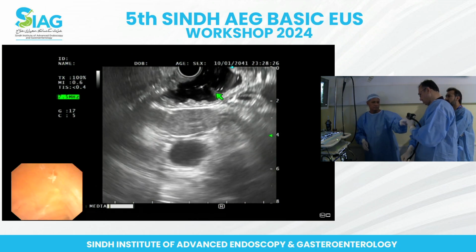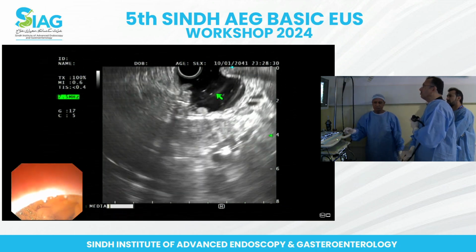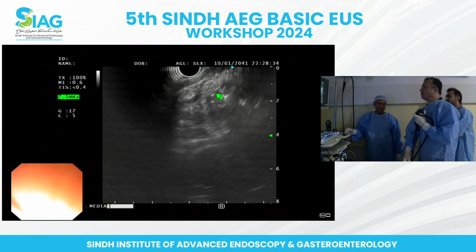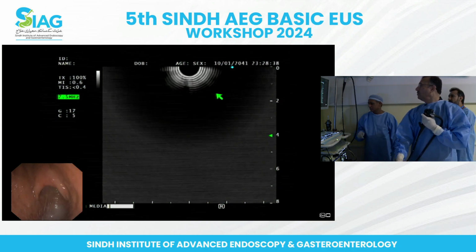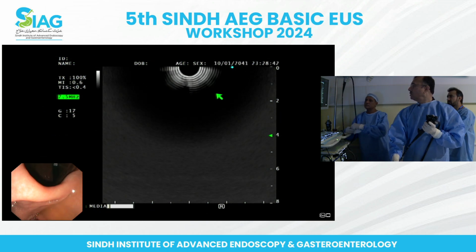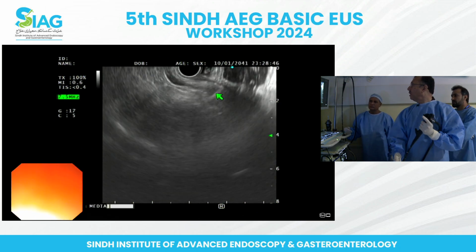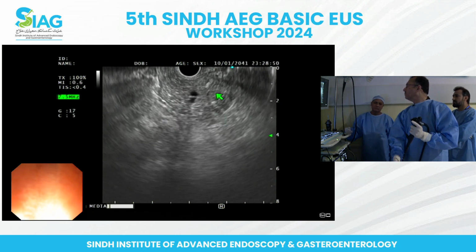ठीक है. Actually, we have a small duodenum and we slip back into the stomach very quickly. So maybe an evaluation once again.